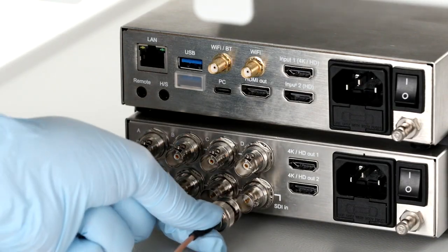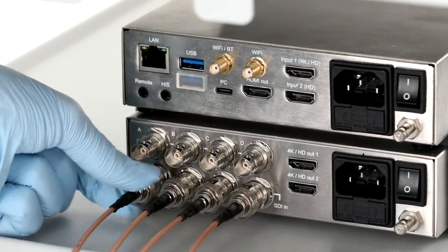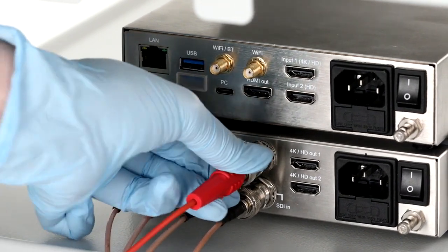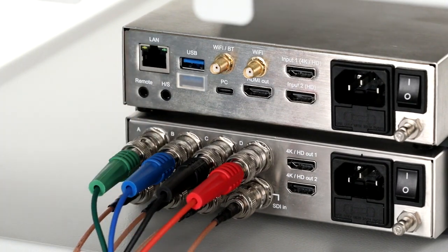3G SDI cables from the camera control unit should route to the converter box, and the converter box should be connected to the monitor using another set of 3G SDI cables. Once that is complete, add the printer to the bottom shelf of the cart.